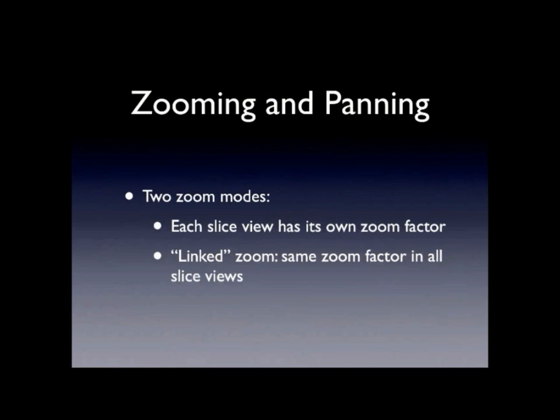Okay, so I'm going to mention a couple more details about zooming and panning. When we're zooming in ITK-SNAP, there are 2 modes available. You can have either the same zoom factor in all 3 windows, or you can have each window having its own zoom factor.